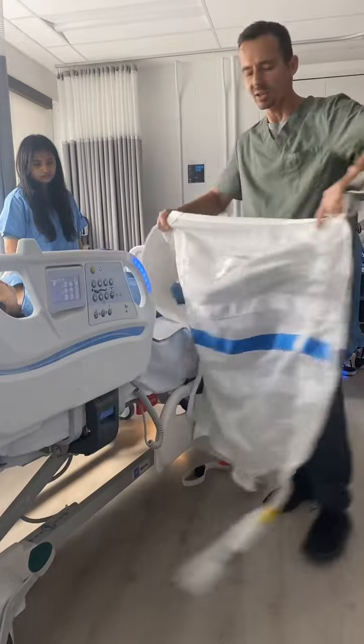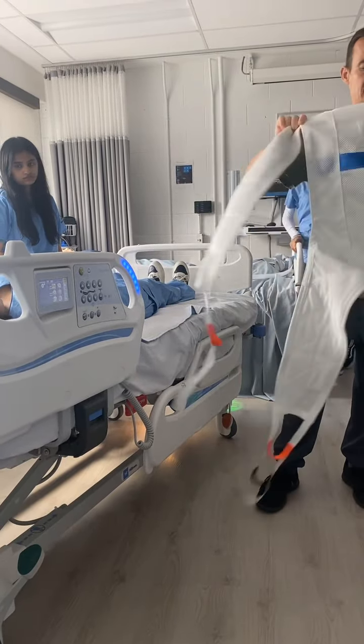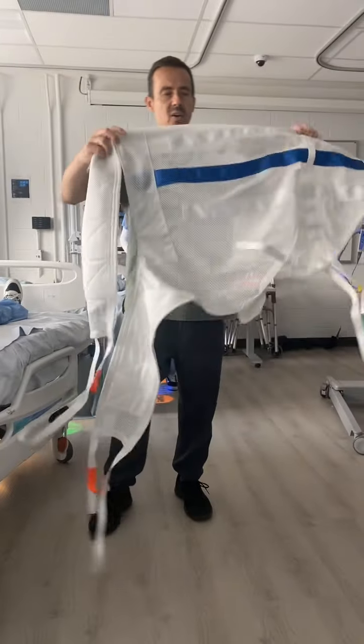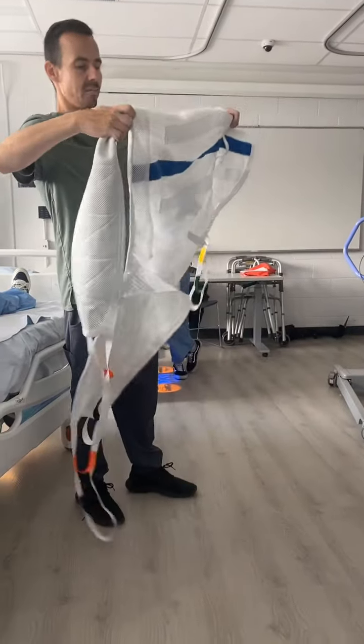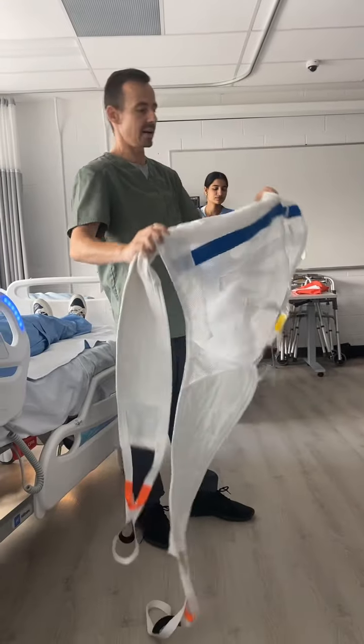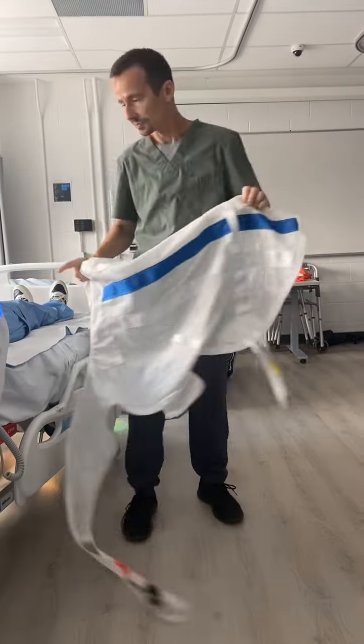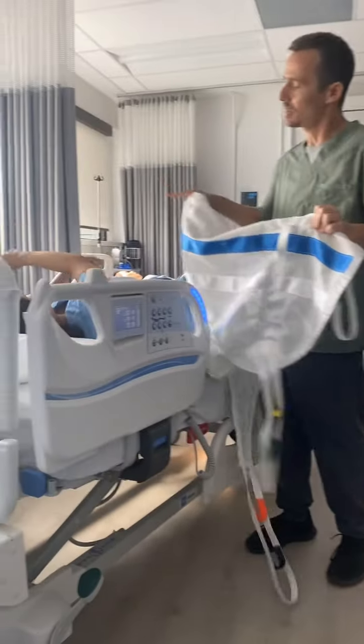How do you get a patient? This patient can mobilize in bed, so I'm just going to instruct the patient how to do it. Usually I roll up the sling about halfway. This is what I'm going to put underneath the patient, right? So the bottom part, the part that's facing the bed, is this part. Can you roll towards your left, please?